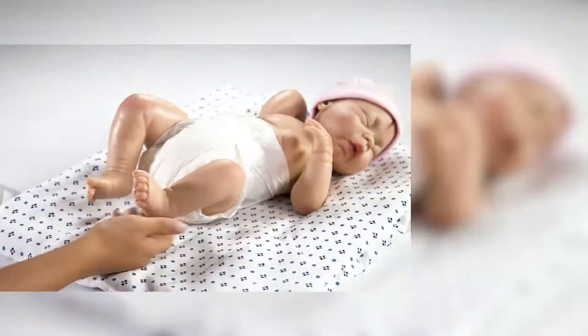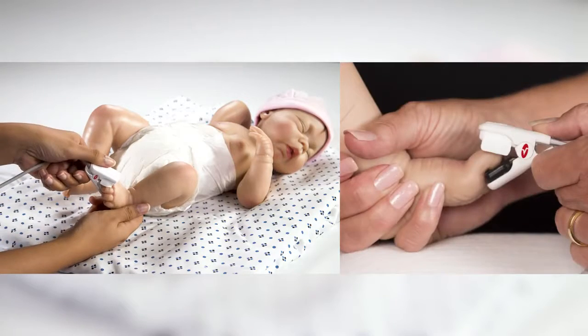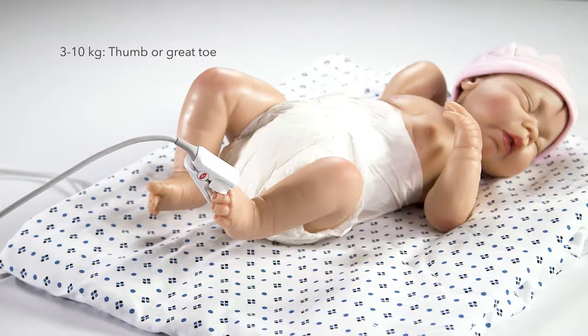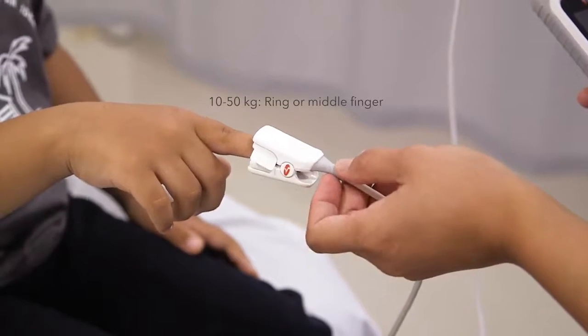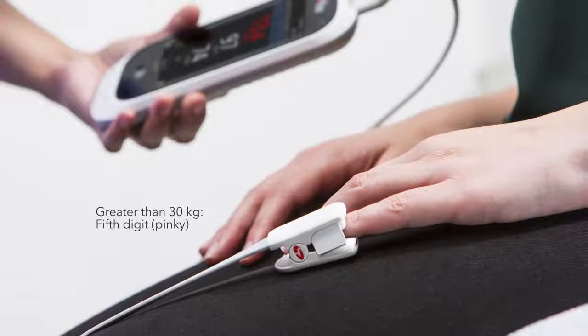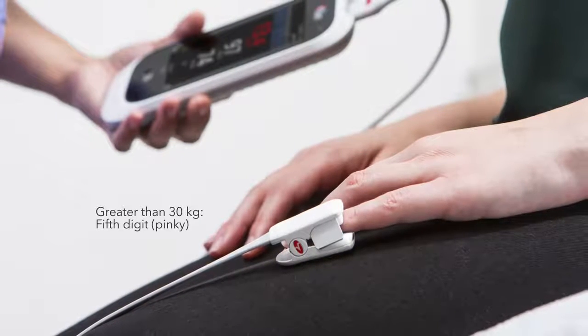Select an appropriate site for sensor placement. The preferred site is determined by weight range. For infants 3 to 10 kilograms, the thumb or great toe are the preferred sites. For paediatric patients 10 to 50 kilograms, the ring or middle finger are preferred. For adults greater than 30 kilograms, the preferred site is the fifth digit or pinky of the non-dominant hand.